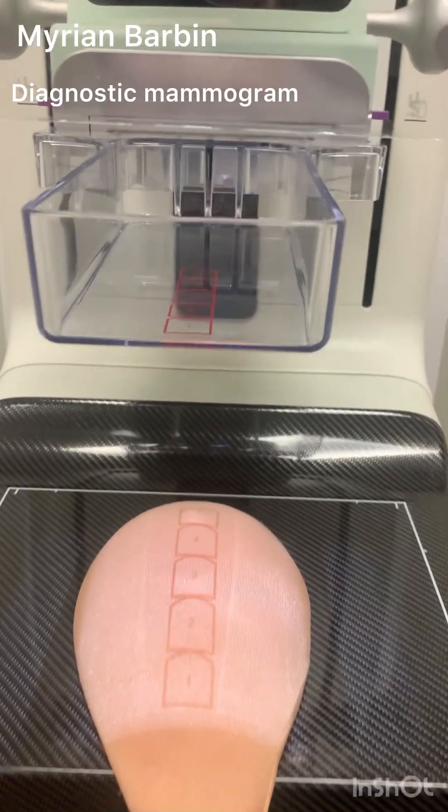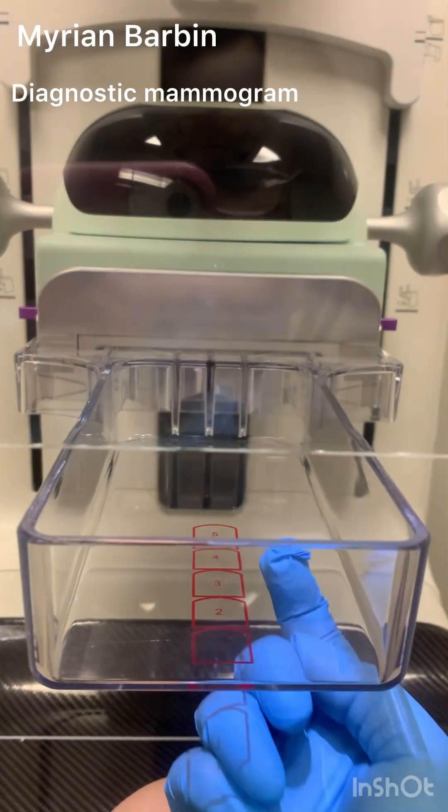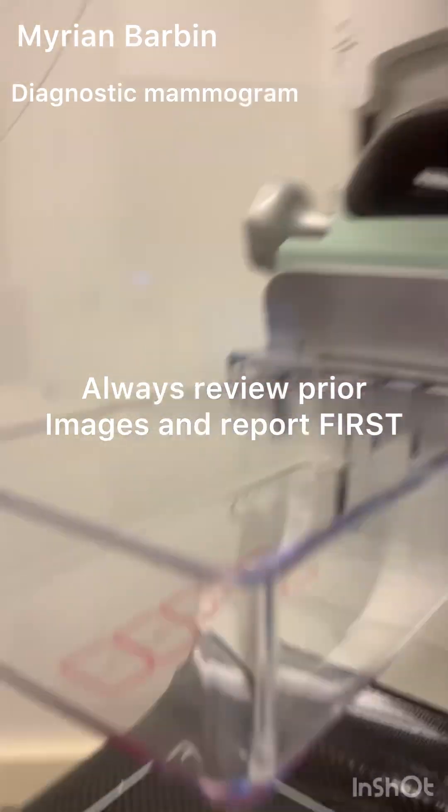Hello, my name is Marian. In today's video, I am showing you how to do a diagnostic mammogram with the spot compression paddle if you are a mammography technologist.